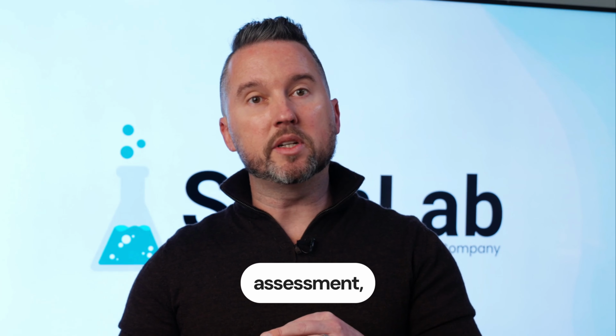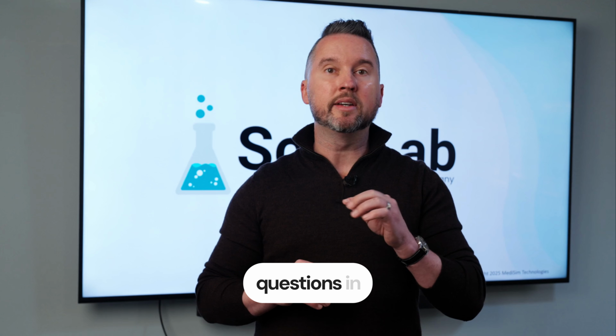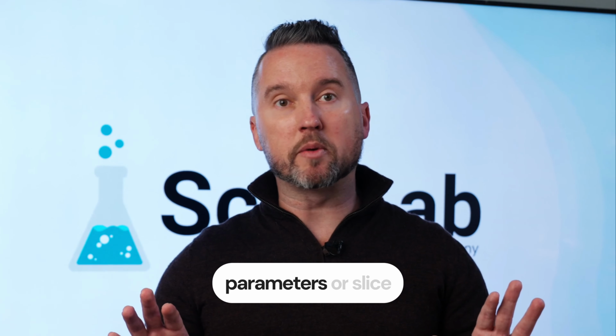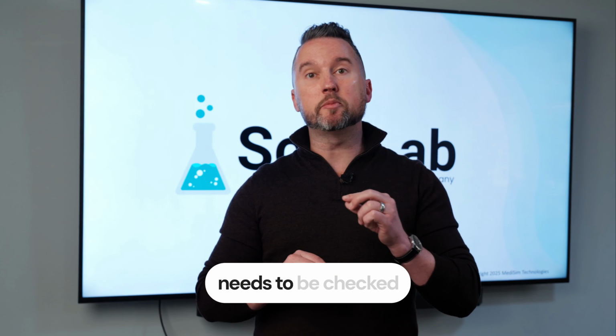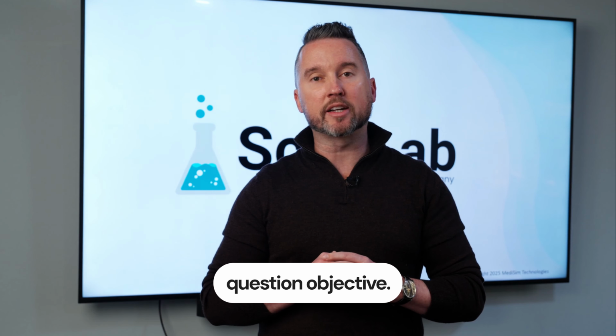Within the skill assessment, you'll be asked to perform specific tasks and answer specially prepared questions in multiple formats and across various categories. In order to understand your technical skill, none of the sequence parameters or slice positions that you are initially presented with are correct. Each parameter across each activity needs to be checked for correctness and adjusted in order to accomplish each question objective.